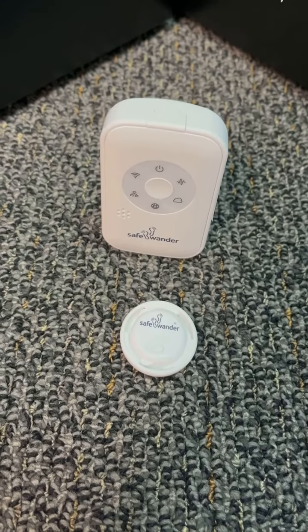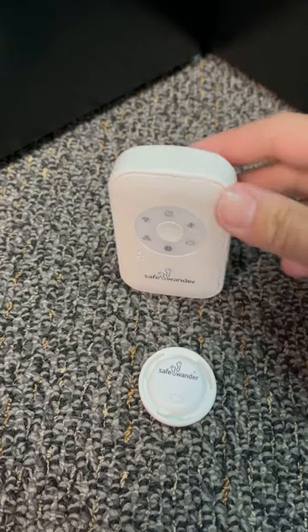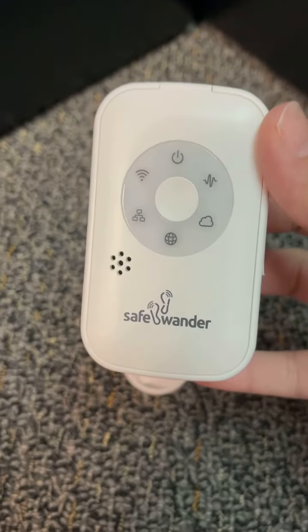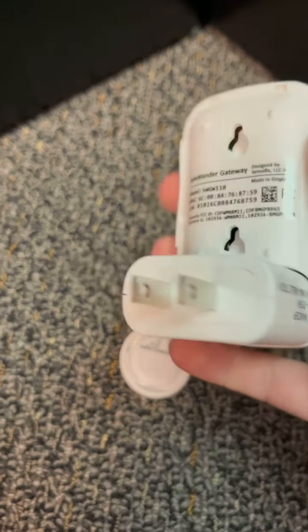This is the SafeWander bed exit alarm sensor. It monitors those who may wander or fall. This gateway plugs into a wall electrical outlet and relays the sensor signal to the internet via Wi-Fi.